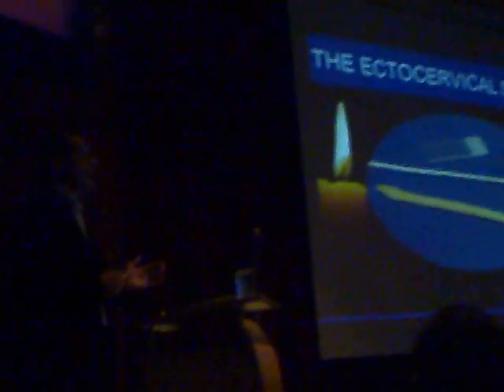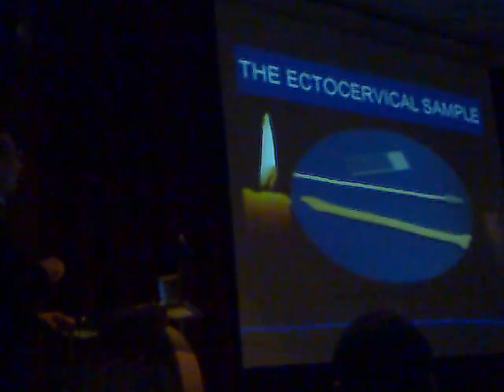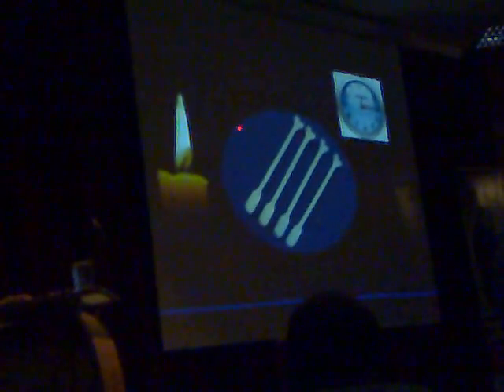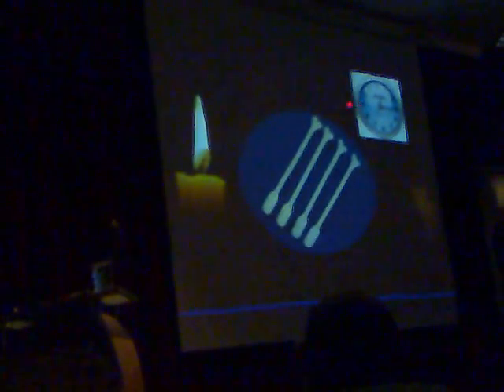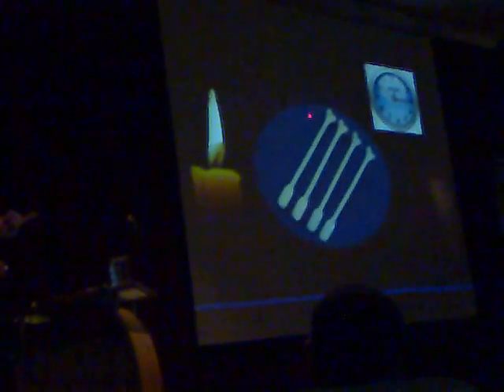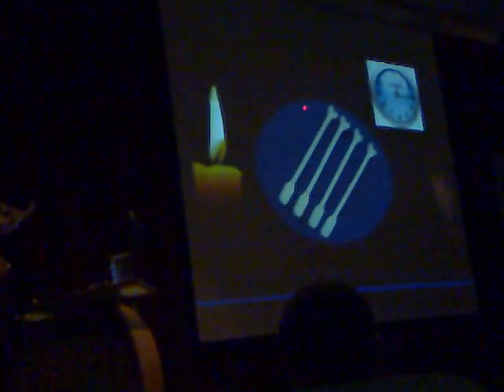I will shift to the ectocervix, how I take the sample from the squamocolumnar junction and the transformation zone. My tool is a spatula, either wooden spatula, or plastic spatula, or many types of spatula. I need to remember that I apply 360 degrees clockwise. The brush 180, the spatula 360 degrees. Not so vigorous, which causes bleeding, not so tight, so no cells appear. You must be smooth. Deal smoothly with the cervix. It will deal smoothly with you.